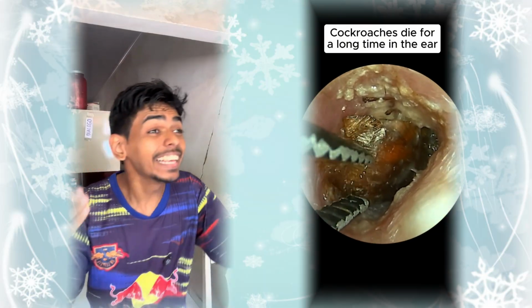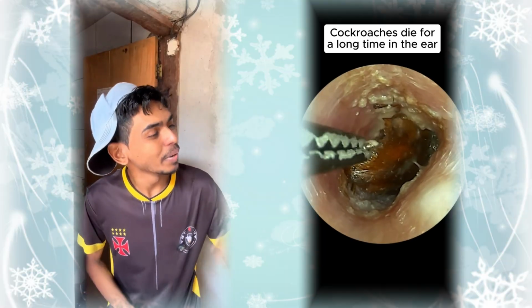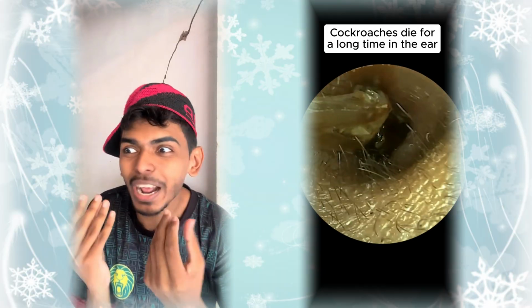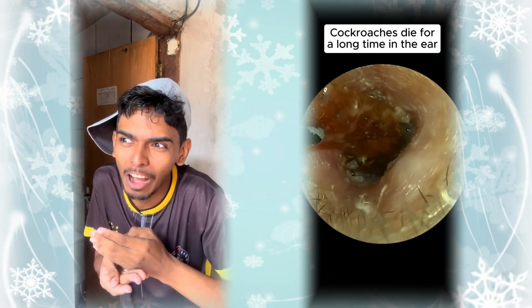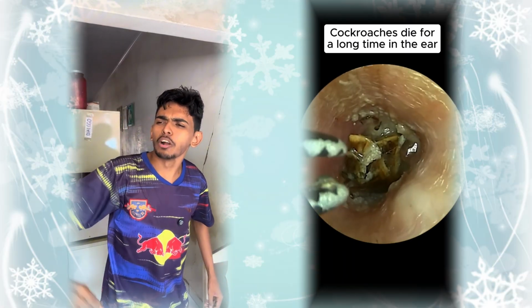So most of the mastoid cavities that we've shown on the channel are really weird looking. You go inside the ear and you think, what in the world is going on here? Doesn't really look like an ear, to be honest. And that's because the cavities that I've shown previously, these patients have had very, very radical mastoidectomies, very radical surgery for cholesteatoma and things like that.